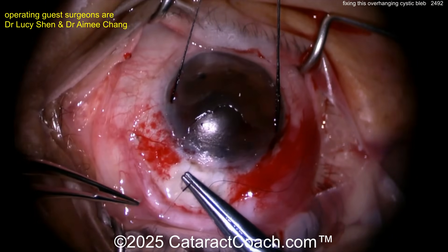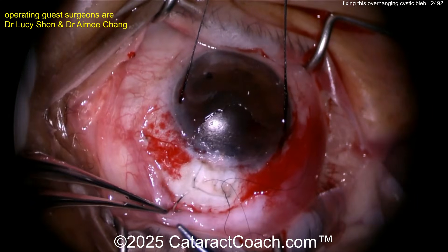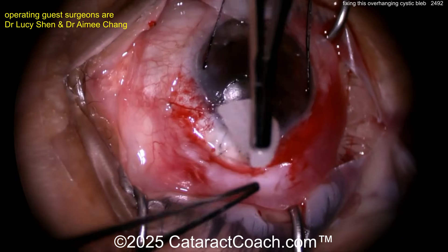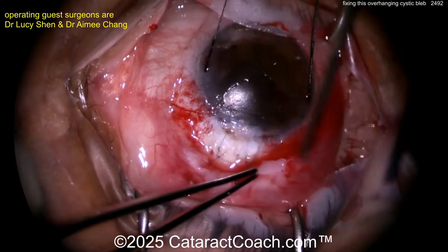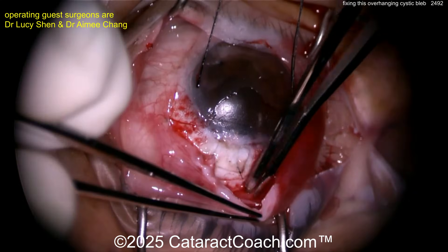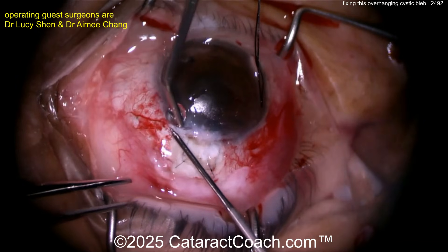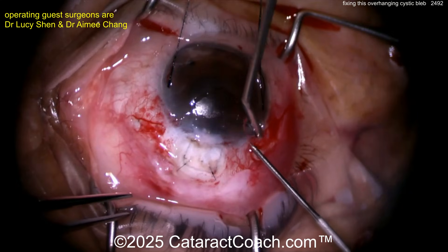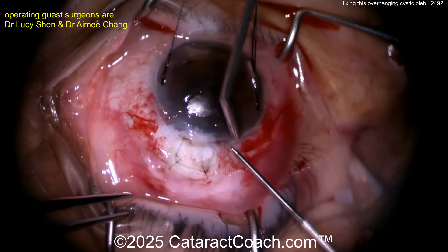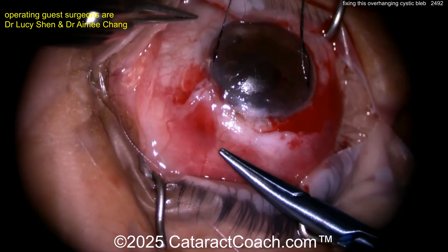To prevent posterior scarring, apply a mitomycin pledget — a small sponge soaked in mitomycin. After you remove it, do a thorough rinse with lots of BSS. Then a little bit of cautery at the limbal vessels to prevent the epithelium from growing under the bleb — an interesting technique.